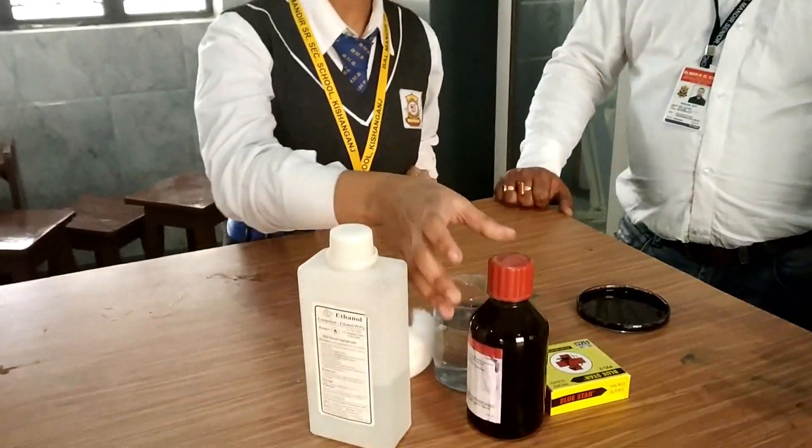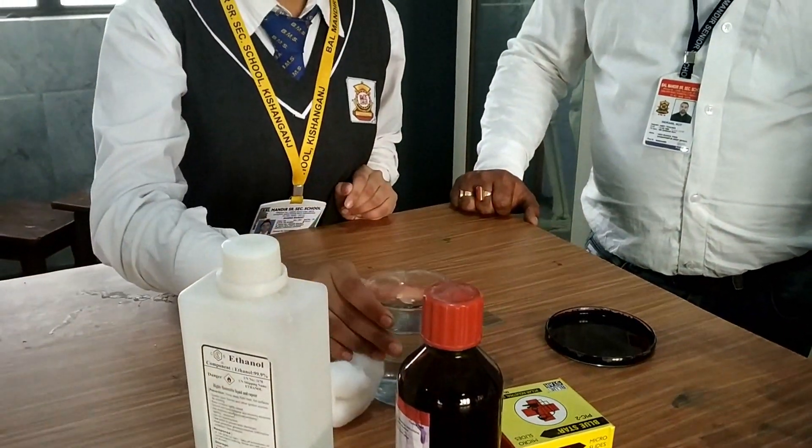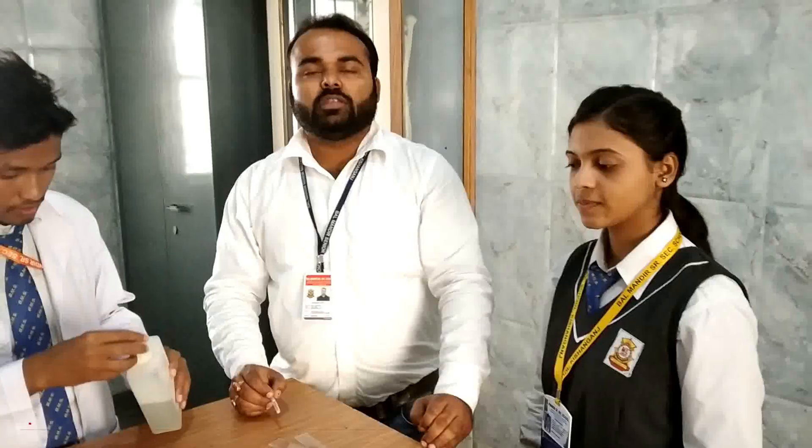Number one is the ethanol, number two is the Leishman stain, number three is the slide, then comes the beaker filled with water, then comes cotton, dropper, and needle. Here we are with the procedure.